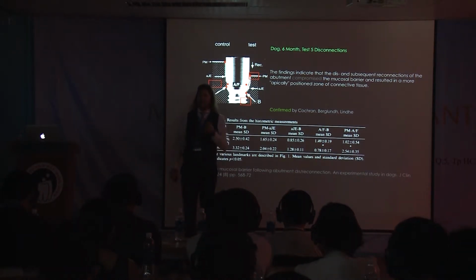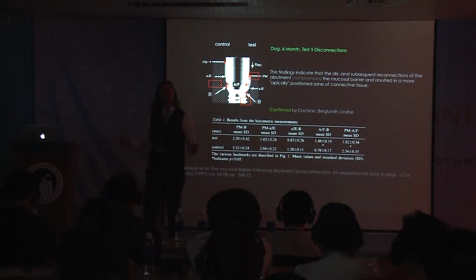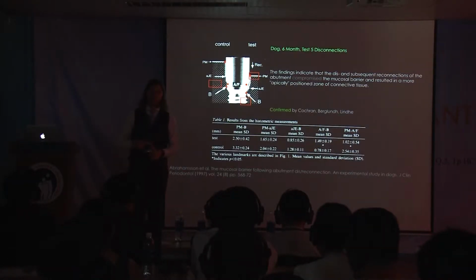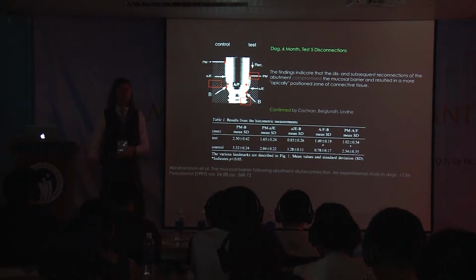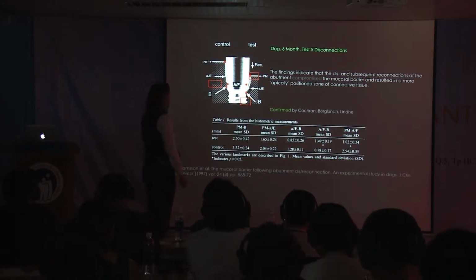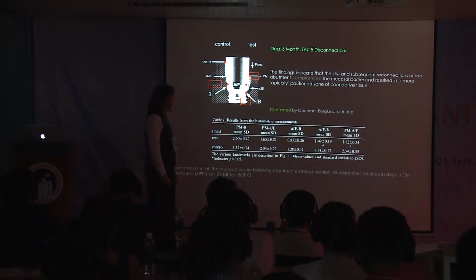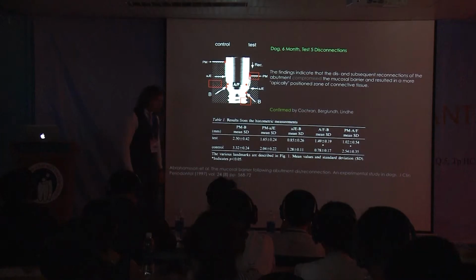Why do we place immediately the abutment where we can? First of all, it will reduce the costs for the patient. She will not have to pay more elements in order to place a provisional. But this is not a reason. The reason is this one.